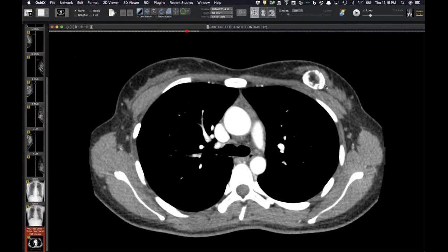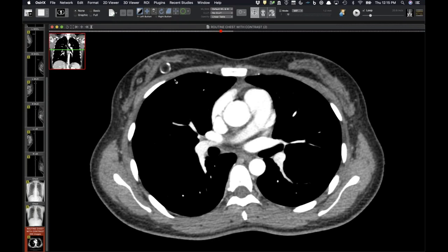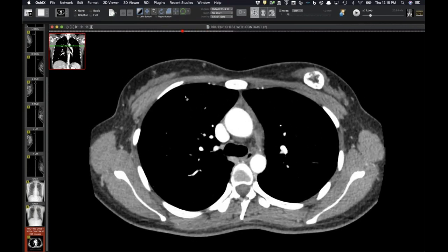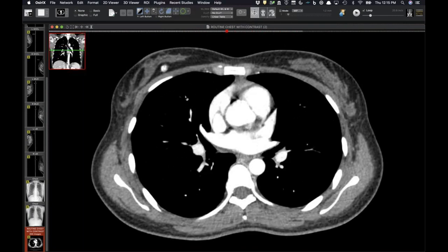And so you can see that's the one that we saw in the radiograph on the left. There's the smaller ones on the right. You can see typical rim calcification, areas of macroscopic fat attenuation within. So bilateral breast fat necrosis showing up on chest radiographs.